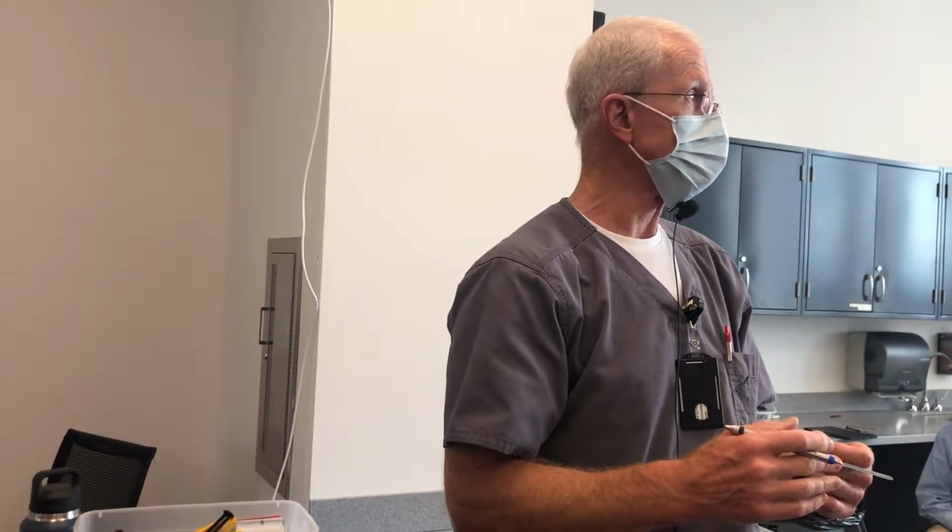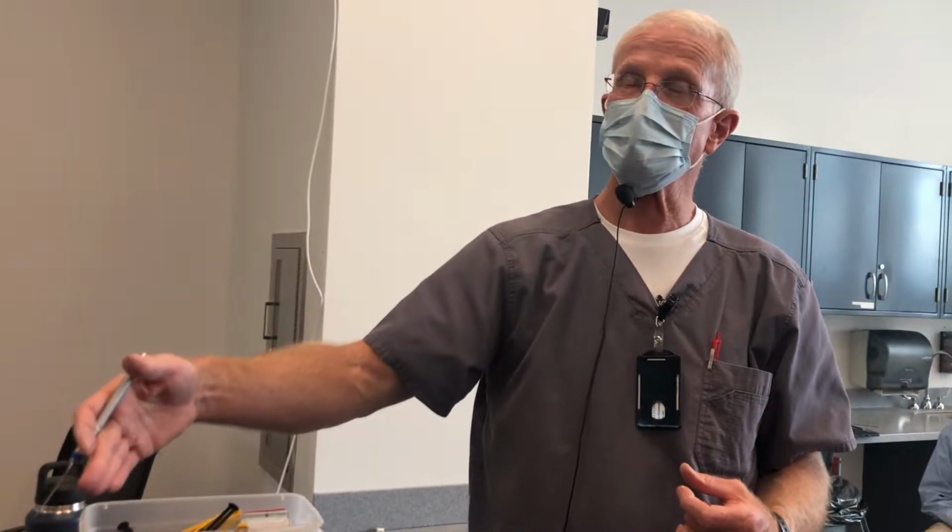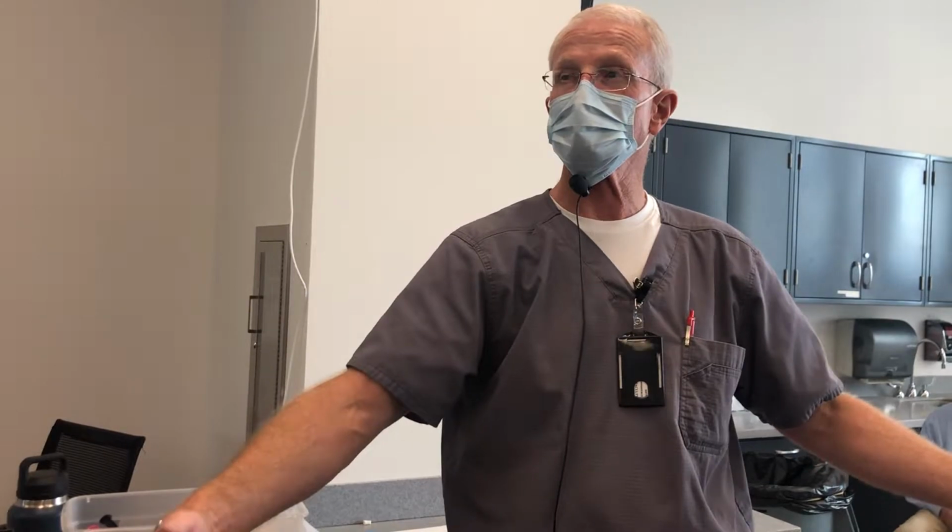That's why clinicians and labs got so good at tightening down gold margins, down to 10 microns. And those still are the very best margins in dentistry, cast gold, where everything has been calibrated along the way, every single step, and a lab that is good at that process, their water-powder ratio, not only with the mixing of the stone, but the investment, which is the mold that the wax pattern goes into, were all calibrated. So that product that dropped out the other end after 6 or 8 or 10 steps, it's really remarkable when you think about it. You'd go back to the tooth now, and this thing would just sit right down in place with really quite smooth margins.